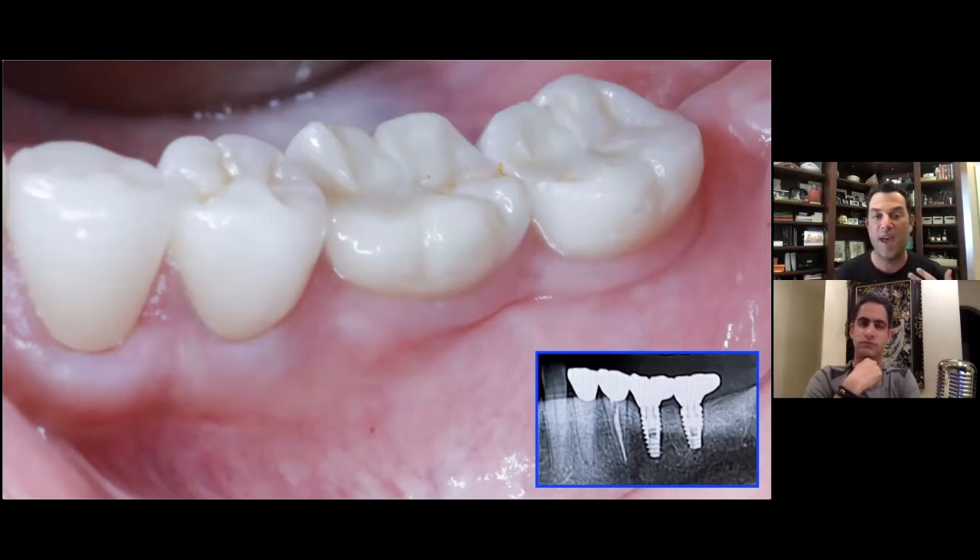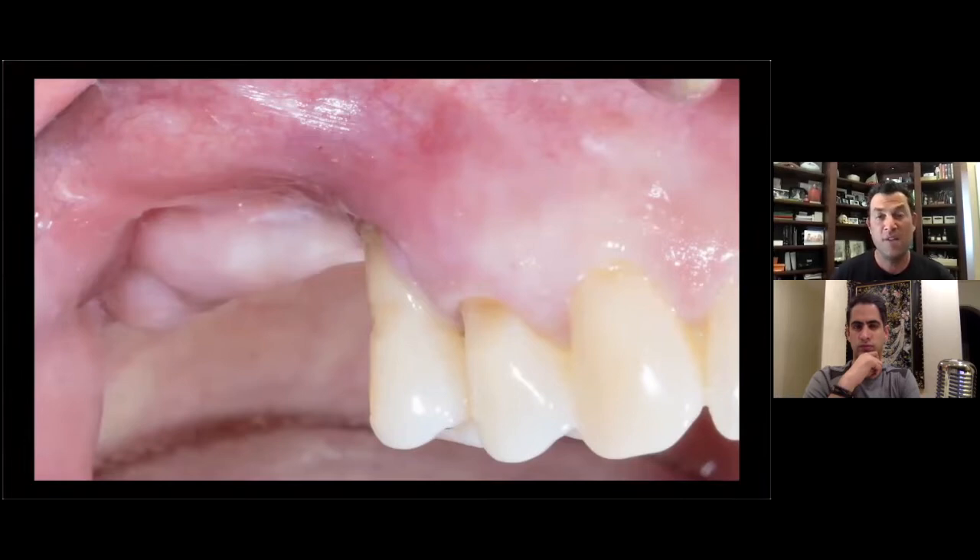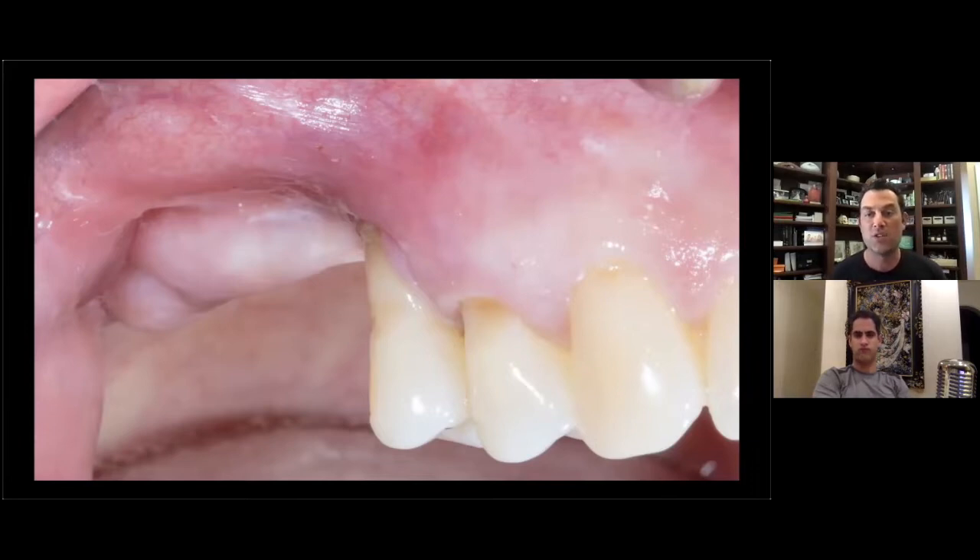In years past I would have been challenged to use much more materials that predispose you to post-operative complications. I've been falling in love with this technique for these types of cases. Here's another example with much more severe bone loss. This technique is really great for horizontal GBR — it's not something I typically use for vertical GBR — but this is a good example of how you can obtain some vertical GBR with this sort of technique if you are overbuilding and perhaps combining soft tissue augmentation.